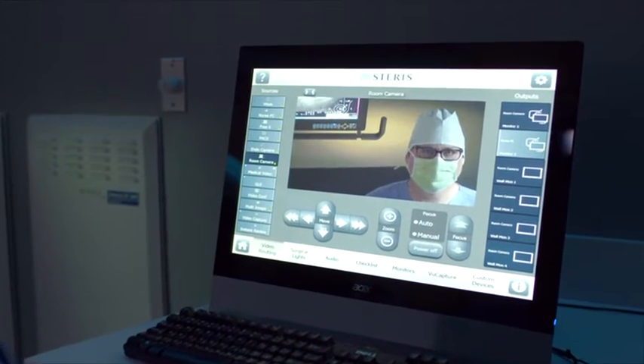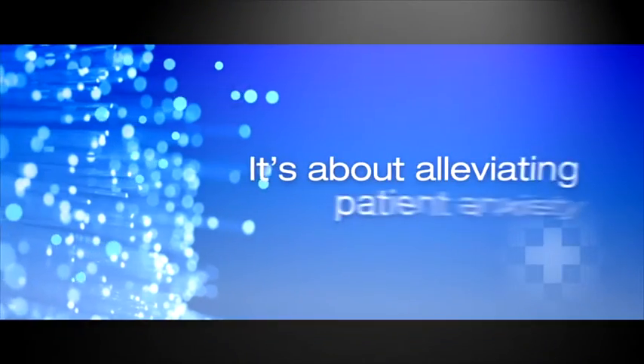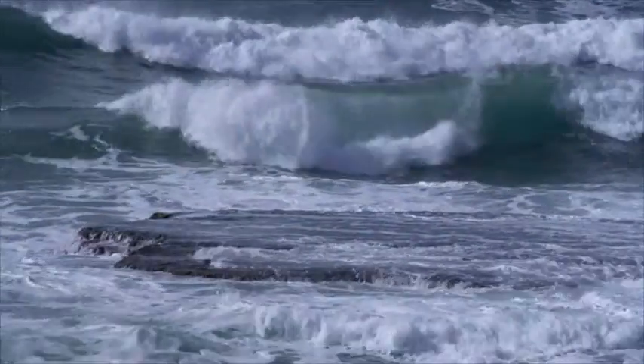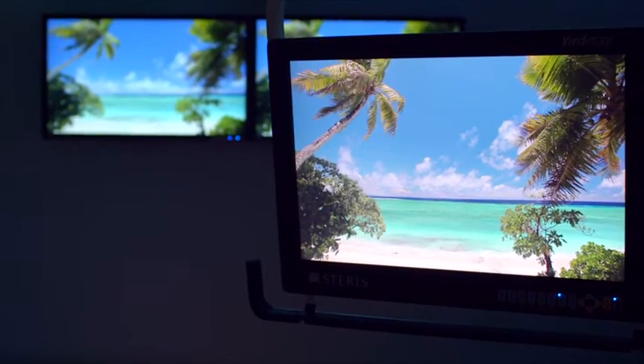We can connect your OR with anyone or anywhere, assuring fast, secure, high-quality communication. Harmony IQ Integration System also means something directly for the patient — create a peaceful, familiar environment for the patient entering the OR through video, sound and lighting.